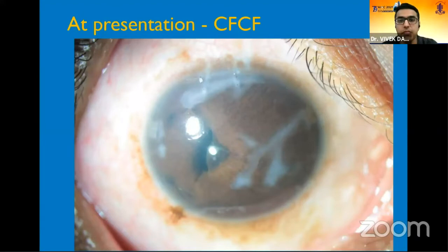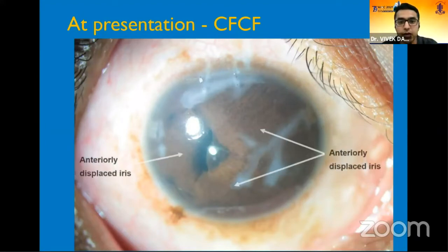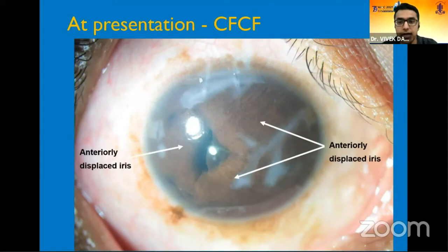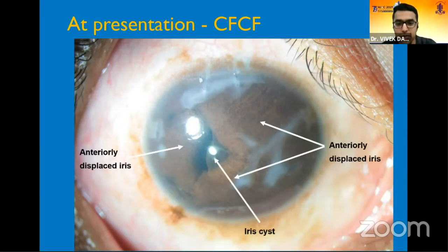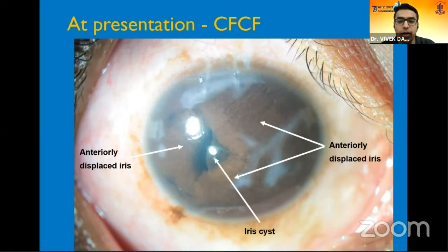Vision was counting fingers close to face. You can see there is an anteriorly displaced iris — the iris has ballooned anteriorly, much like an iris bombé, but with a lobulated appearance. Right in the visual axis you can see this brownish translucent reflex representing the iris cyst, due to constant contact of the iris with the corneal endothelium.